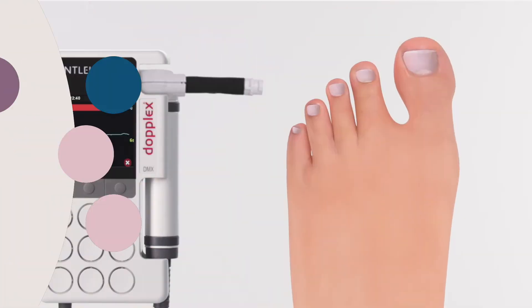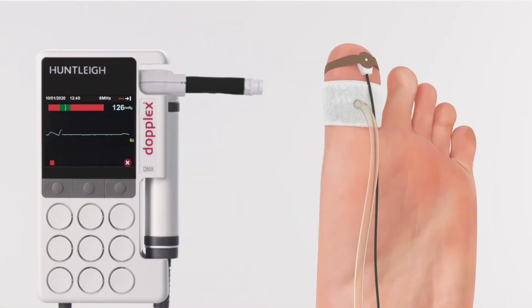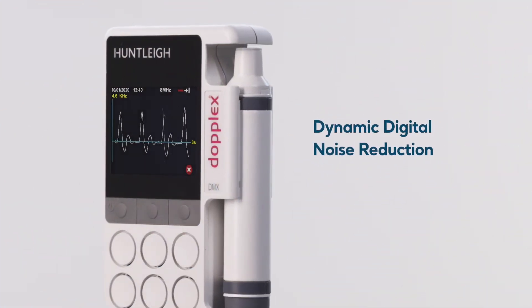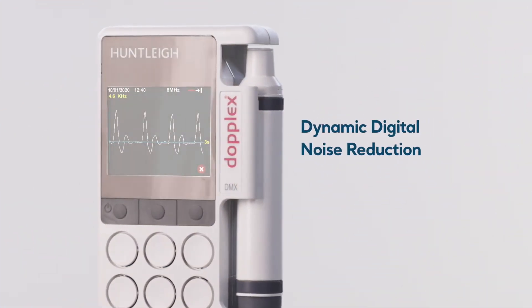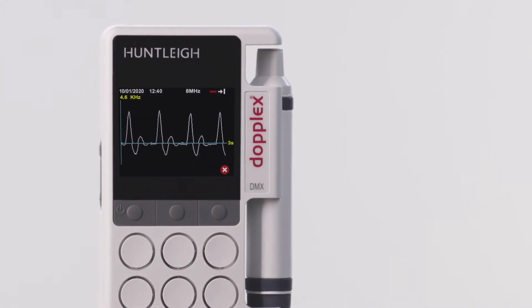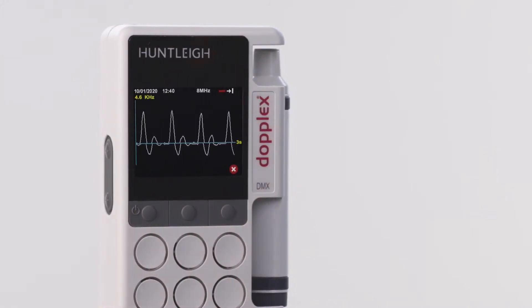With the DMX, measuring TBIs is significantly easier. Using the optional PPG sensor and toe cuff is all you need. Added to all this is a dynamic digital noise reduction system, which reduces background noise, along with our latest digital algorithms. The DMX is our best vascular Doppler ever.